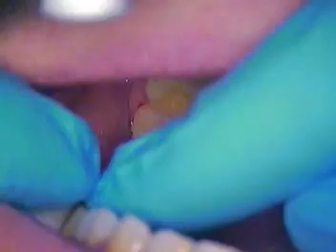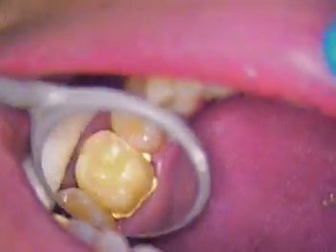And we just try to get as much as we can. Boy, this is fast, quick, and let's get it in. Push it up in place. Close down, Oleg, all the way. Open. Let's see if that's seated all the way. I hope. Tap, tap, tap down. Does that feel okay to you?